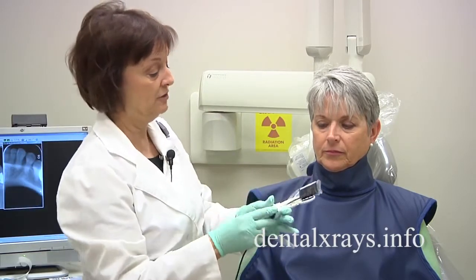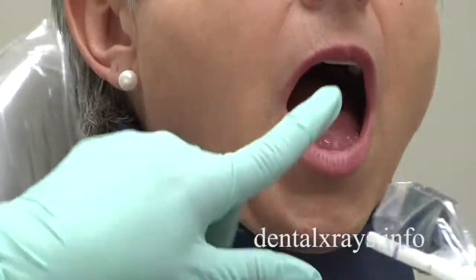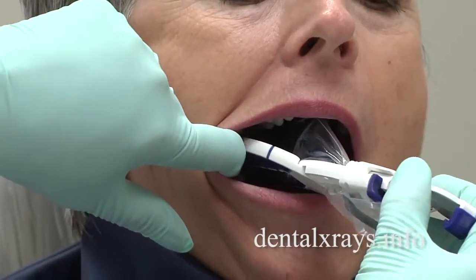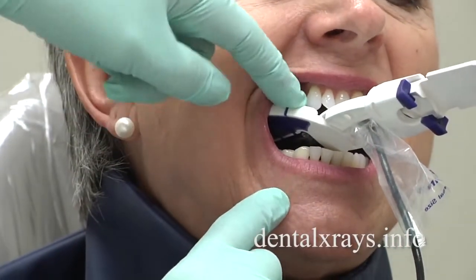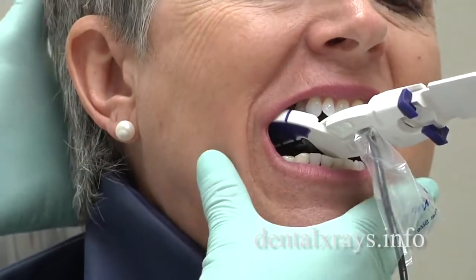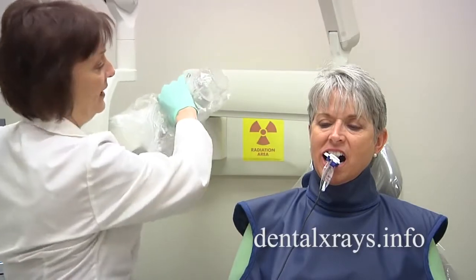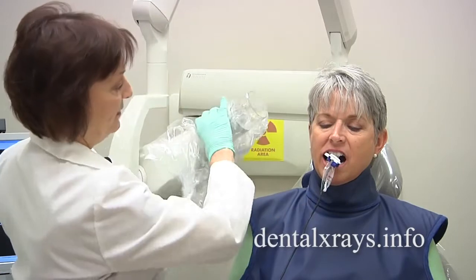So let's put this in and show you how much easier this is with this holder. Again, we'll do the upper premolars — I'm going to slant it like so, retract the cheek out, slide it in, and have them gently close until her teeth are actually on the apparatus itself. So it's perfect like that. Adjust the head so that the occlusal plane is horizontal to the floor. Then you'll take your x-ray tube and if you can actually see the angle of the film or sensor in the mouth, you're going to bring this up to determine the angle.